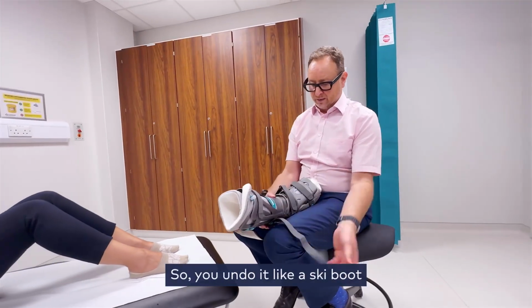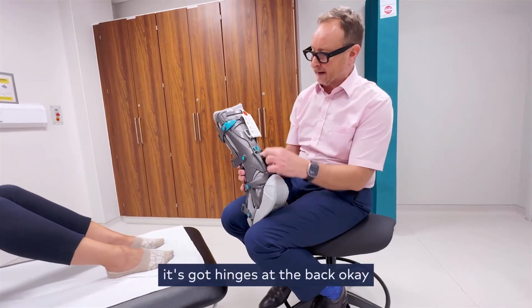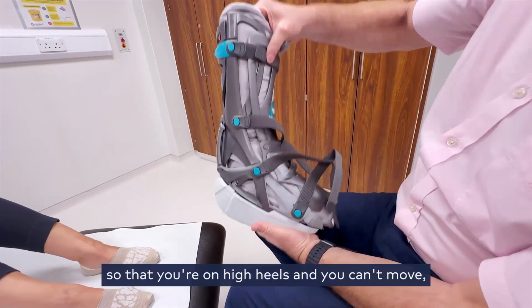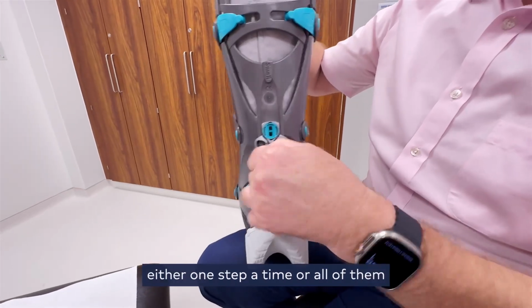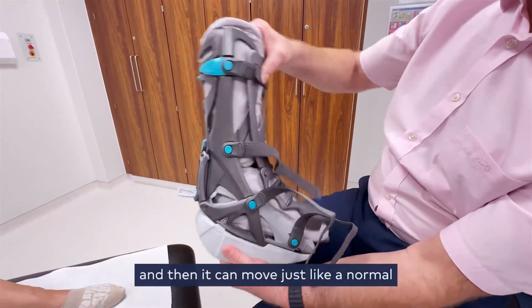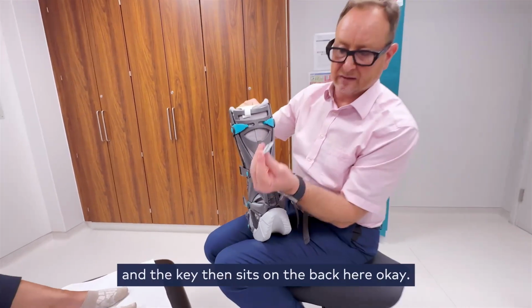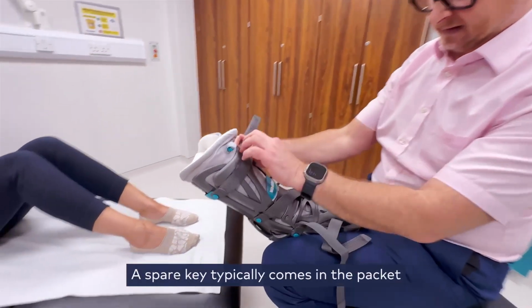So you undo it like a ski boot. It's got hinges at the back, and what the hinges do is they lock, so that you're on high heels and you can't move, so you can weight bear on it. But if you want it to hinge, you can release them either one step at a time or all of them, and then it can move just like a normal shoe or boot. I'm going to lock it in the locked position, and the key then sits on the back here. A spare key typically comes in the packet, and I'll show you that in a second.